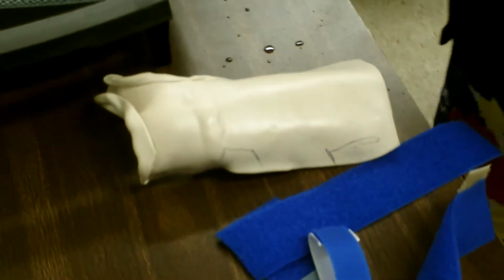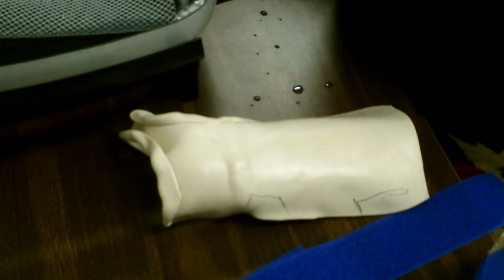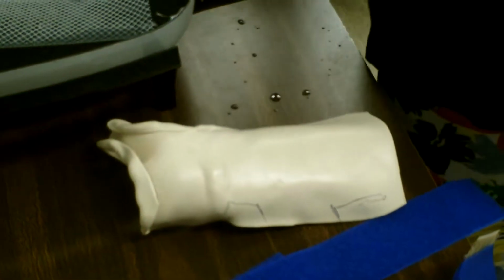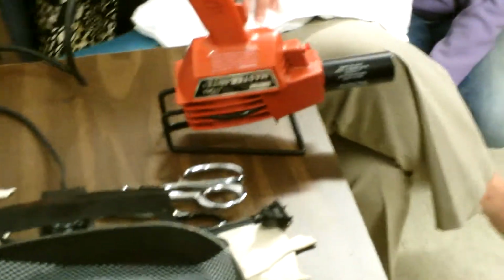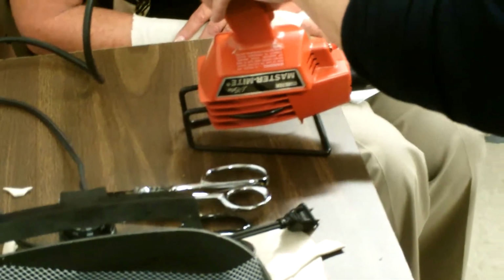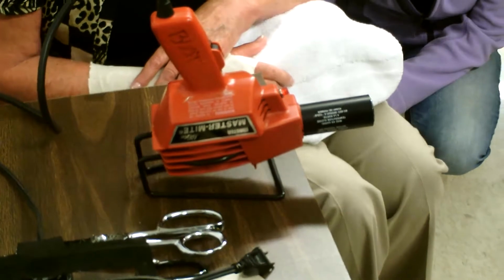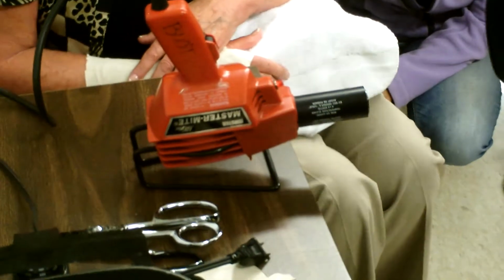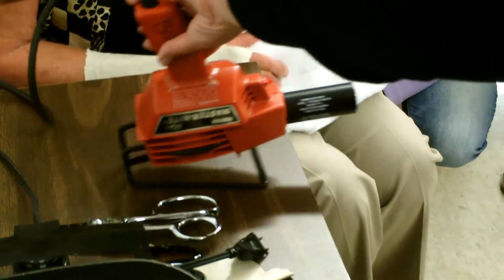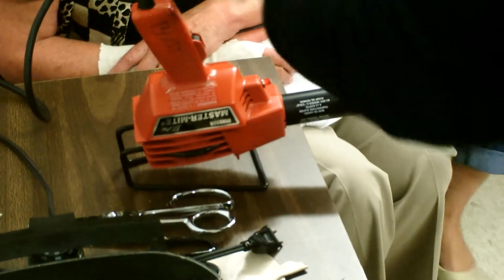This is like a hairdryer, but it will burn you really badly. It's like a super high temperature hairdryer. So when you use it, make sure you turn it on. It gets really hot quickly. As soon as you're done using it, put it to the middle setting, which is cold air. That helps the heating element to preserve it. So put it to cold as soon as you use it, and then you can just leave it on the counter for your friends. When we're done our splinting session, turn them off.